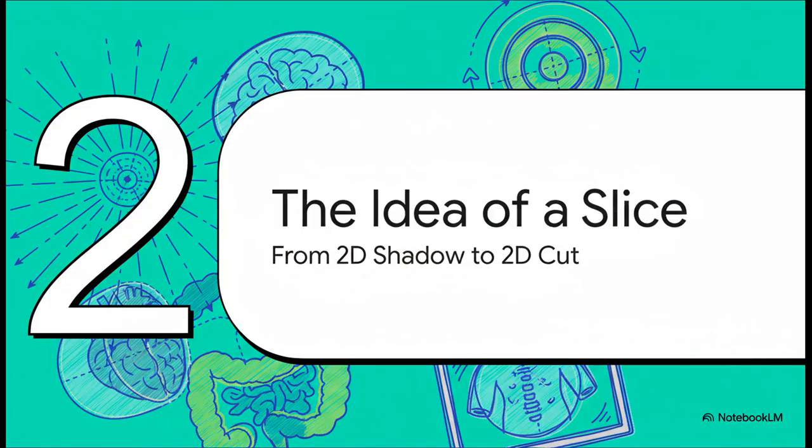This big limitation is what led to a truly brilliant idea, a huge conceptual leap. Instead of trying to make sense of that flat, messy shadow, what if you could just isolate and image a single two-dimensional cross-section? Going from a 2D shadow to a true 2D slice, that was the absolute game changer.